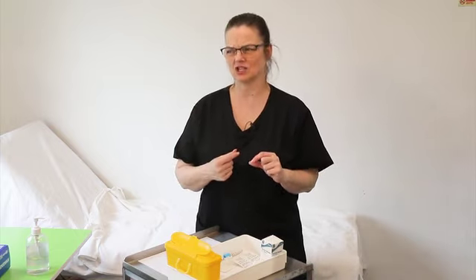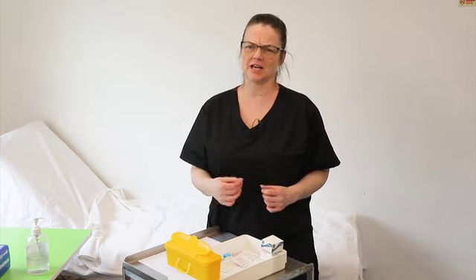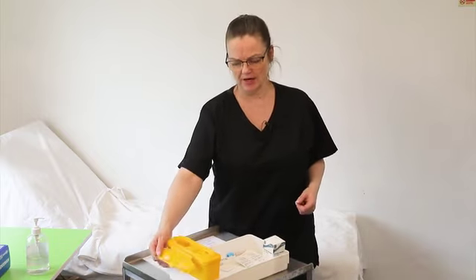Give the injection, then give it over 10 seconds, and then you can release it and remove the needle. Do that quickly. You don't need to leave the needle in the skin for subcutaneous for any length of time. You're just going to count to 10 or more, but because it's usually a small injection, 10's fine. And then just put it straight into the sharps bin.